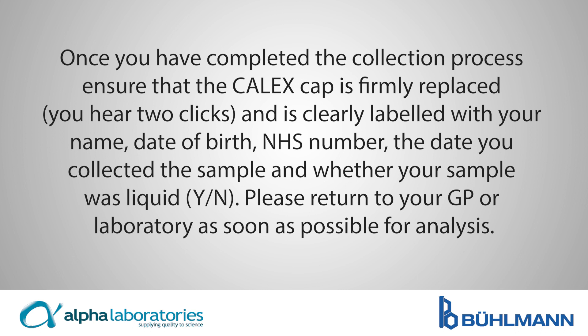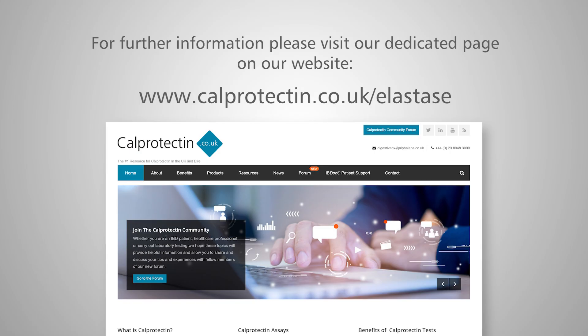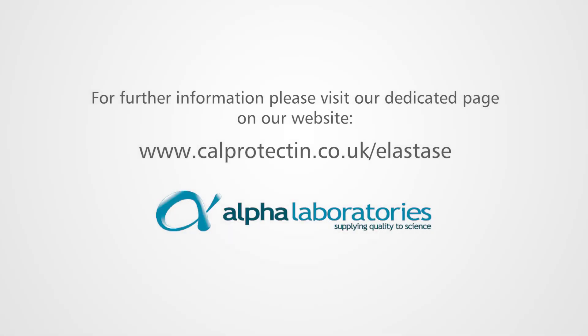Once you've completed the collection process, ensure that the CALEX cap is firmly replaced and it's clearly labeled with your name, date of birth, NHS number, the date you collected the sample, and whether your sample was liquid. Please return to your GP or laboratory as soon as possible for analysis. For further information, please visit our dedicated page on our website: www.calprotectin.co.uk/elastase.